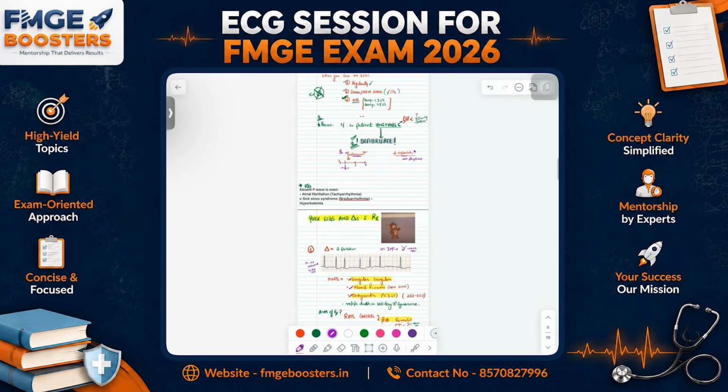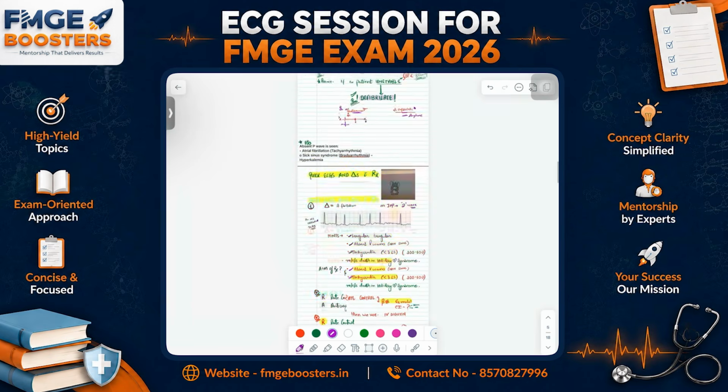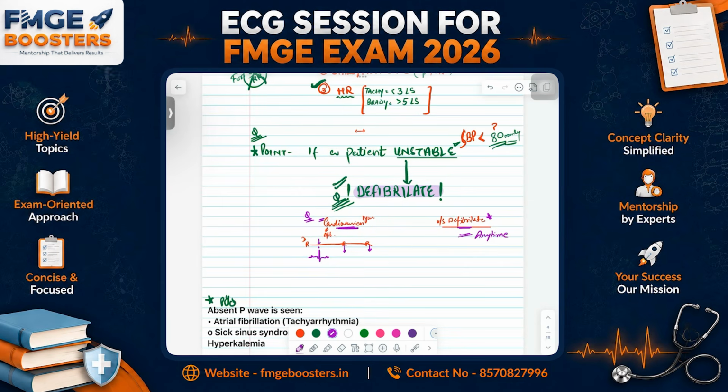डिफिब्रिलेशन पहली बात अनसिंक्रोनाइज्ड होता है. इट इज नॉट सिंक्रोनाइज्ड. एंड व्हेनेवर द पेशेंट इज इन शॉक, उसका BP कम है, पेशेंट इज अनस्टेबल, वी विल नॉट डू कार्डियोवर्जन, वी विल डू डिफिब्रिलेशन. बेशक दोनों में हमें शॉक ही देना है, बट कार्डियोवर्जन इज सिंक्रोनाइज्ड मोस्टली, इट इज सिंक्रोनाइज्ड विद द R wave. दैट्स व्हाई कार्डियोवर्जन हम इन केसेस में देते हैं, लाइक आई टोल्ड यू, ए फिब में, ए फ्लटर में आया था ना वहां पे. ए फ्लटर में RACE, फ्रॉम E was electrical cardioversion.